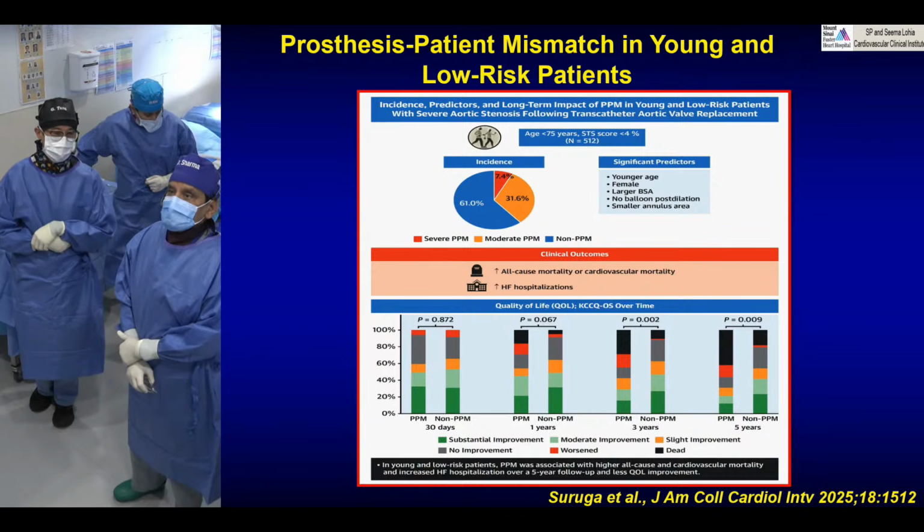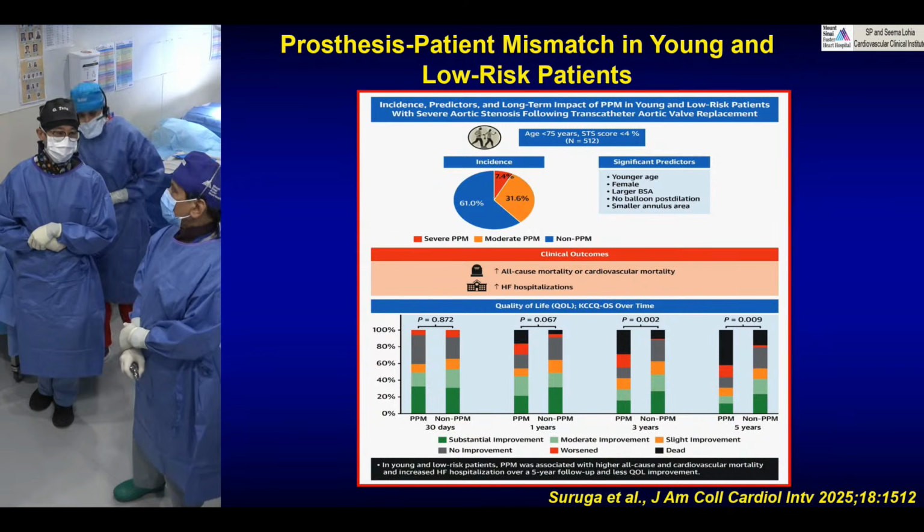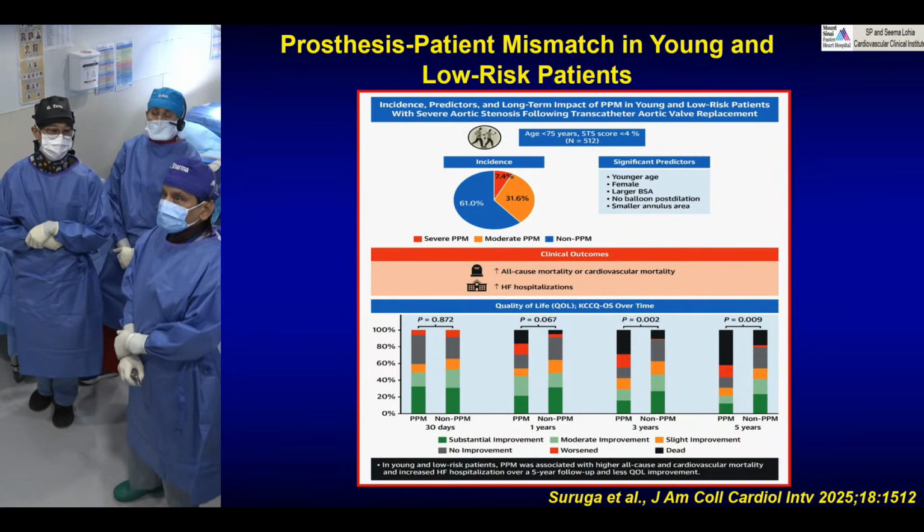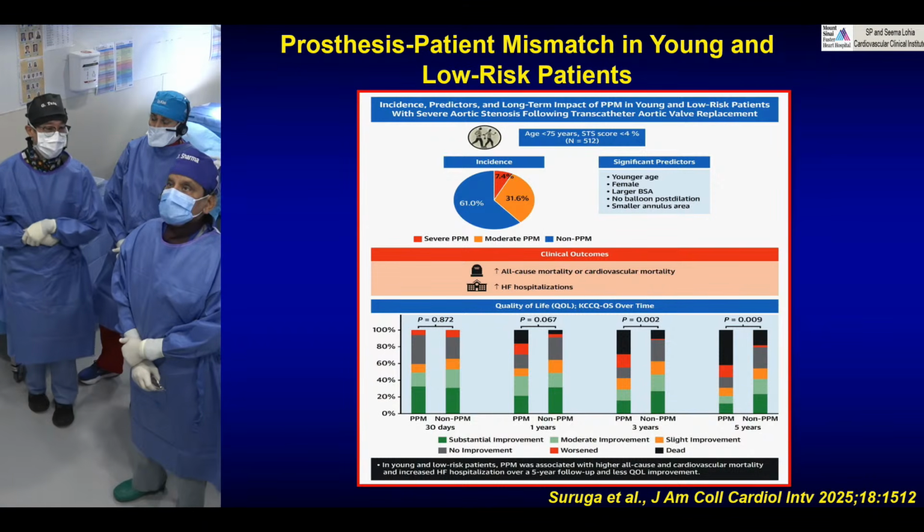We've also published that when we put the smaller valve in but better expanded, it actually has better frame expansion, more complete expansion, in fact, and no trade-off in hemodynamics at all.